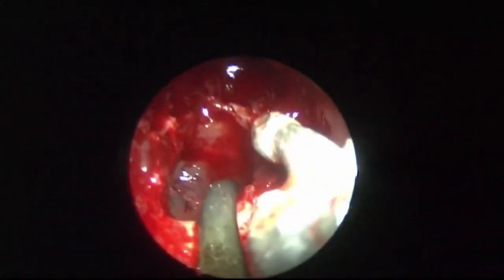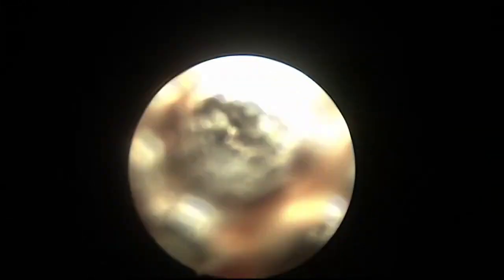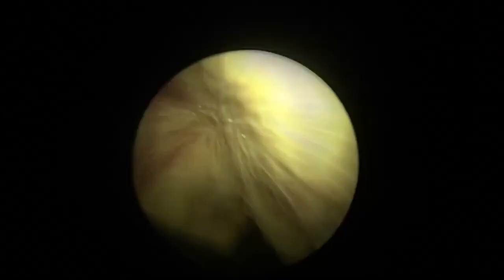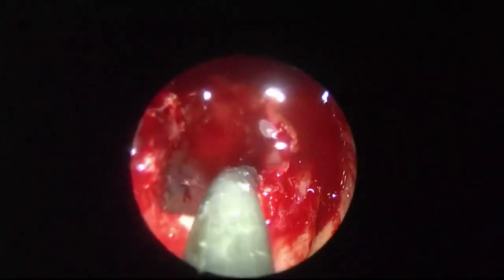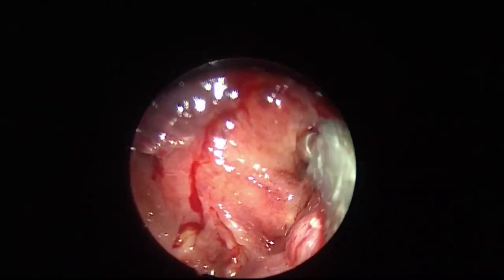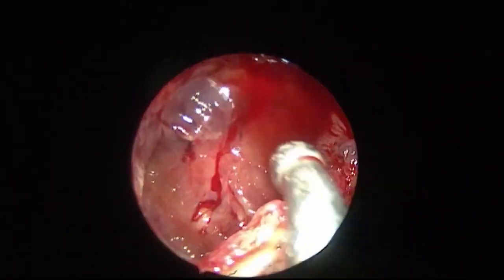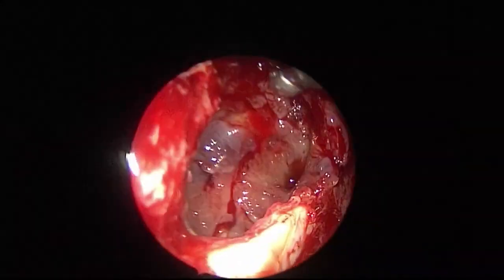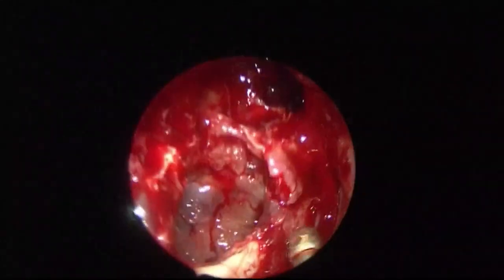And again, there could be... See this now, inside? Yes, you can see that. Clear. See, not even a trace of it. Could be a little bit more. Is there some debris? Yeah. We'll flush it more.